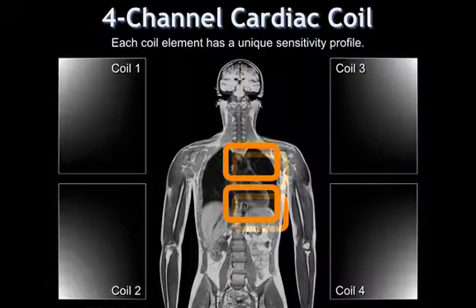So again, if we're talking about acquiring an image that's perpendicular to the subject, each of these four coils is closer to one of the corners of the image, if you will, and each of the coils has a sensitivity profile that's highest or largest in the corners of those coils. That means that the receiver coil itself colors the acquired data, right? Meaning it gets high sensitivity for magnetization that's close to it here and not as strong further away. That doesn't mean that the transverse magnetization is weaker here. It's just the coil's ability to detect the magnetization is weaker there.